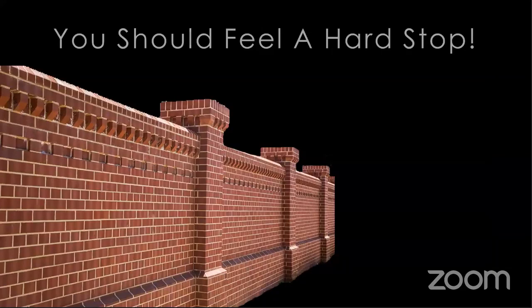So while we're doing this by feel, we know that you should go through soft bone, and then it should feel like you're hitting a wall, something very, very hard. And this is one of the only implant insertion techniques where you can also utilize your ears. Your ears can be very important because if you're utilizing the osteotome, you can listen to the difference in the sound from when you're tapping the osteotome through the very soft type 4 bone of the tuberosity to the very dense type 1 bone of the pterygomaxillary complex. You'll hear a difference in the sound, and you'll also feel a difference tactilely. And so you get two ways to determine if you're at the right spot.